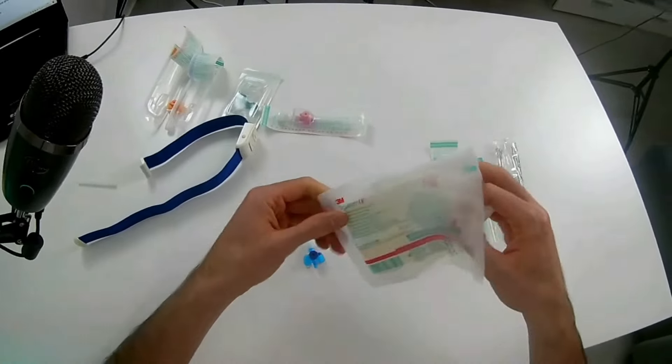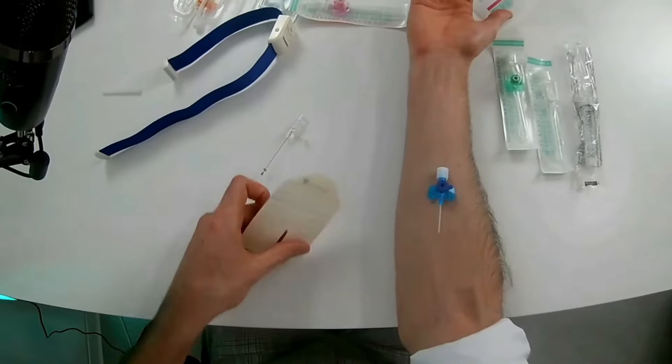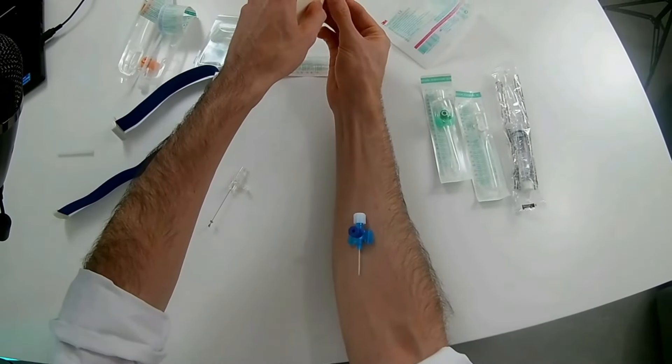And at the end you want to fixate it with this special fixation. You can use anything, actually. This is the one we have at my hospital, which is nothing special, but I guess since I have it I might as well just use it.